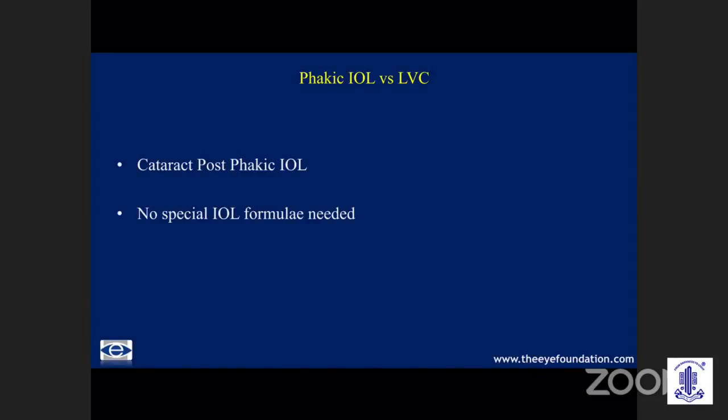So I would like to conclude that there are obviously a large number of advantages of the phakic IOL over laser vision correction, which makes it my procedure of choice for even the low refractive errors.